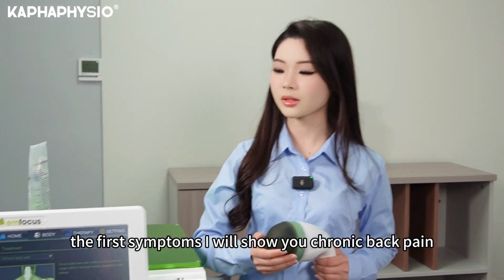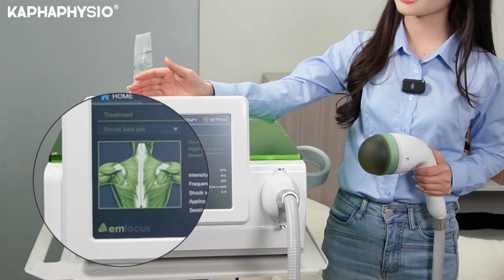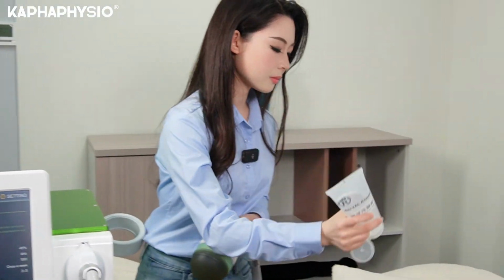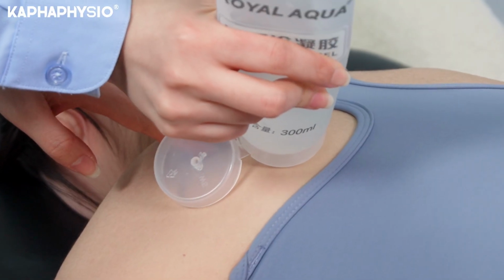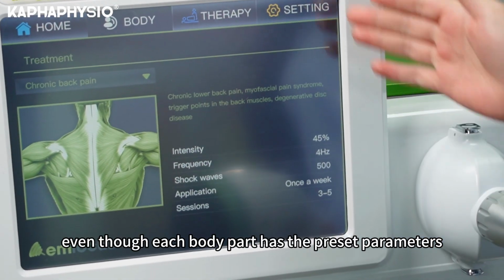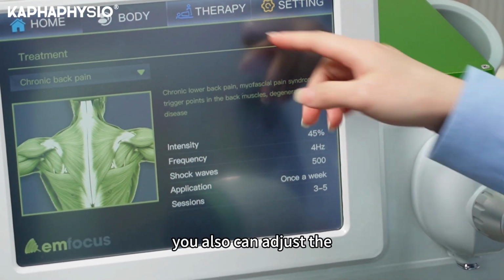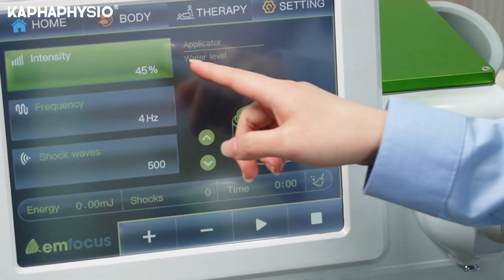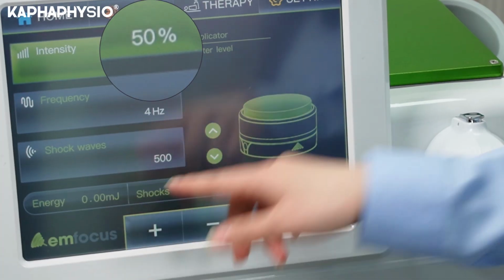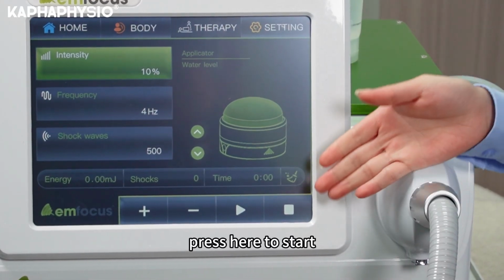The first symptom I will show you is chronic back pain. We need to apply gel to the treatment body part first. Even though each body part has preset parameters, you can also adjust the intensities on the therapy page based on your needs. Press here to start.